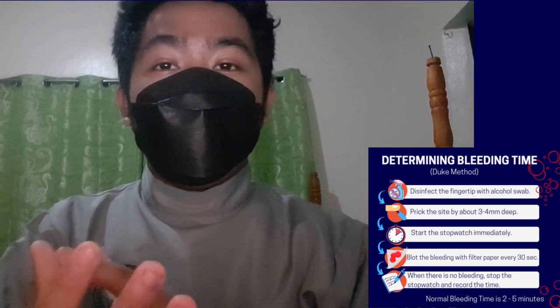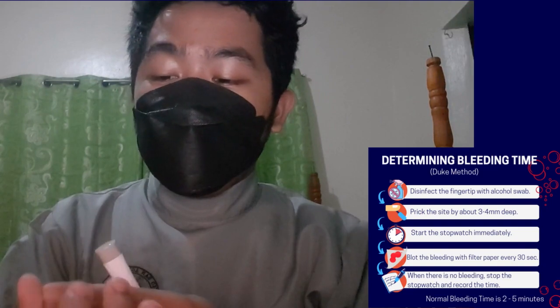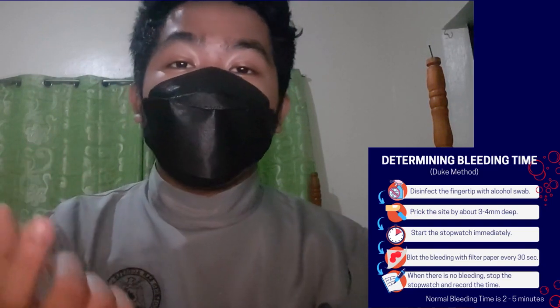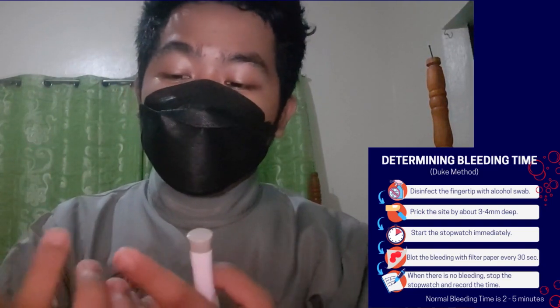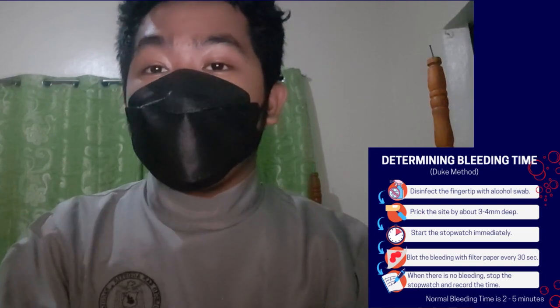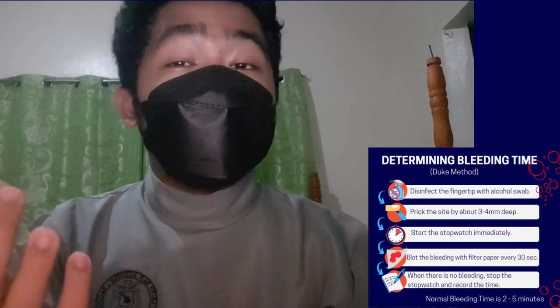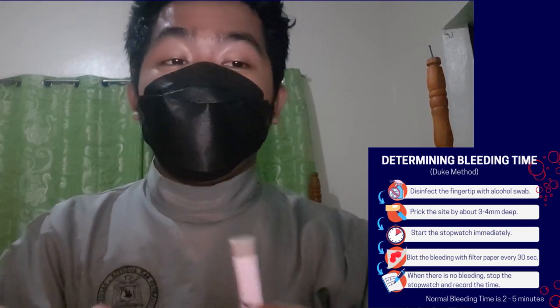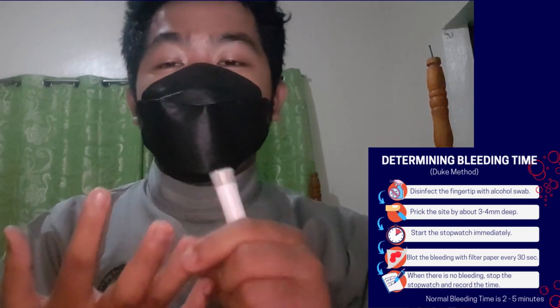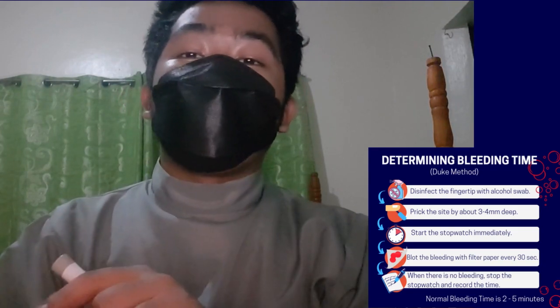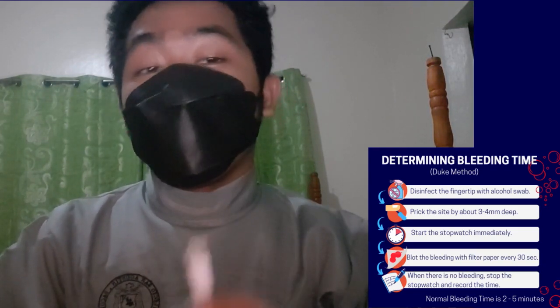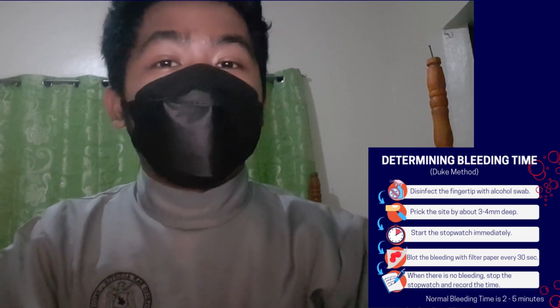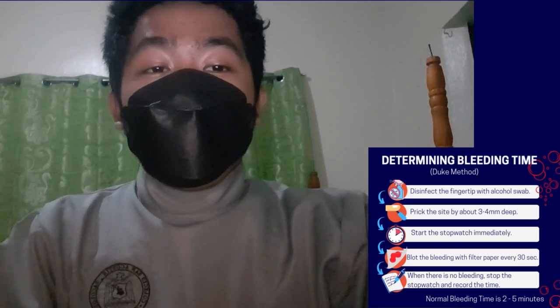Your index finger has more calluses due to it being used always in repeated tasks, which is why it has thicker calluses. Thicker calluses means a deeper cut is needed. Also, the ring finger is preferred for pricking because it is relatively painless compared to other fingers, as it has a smaller nerve supply.